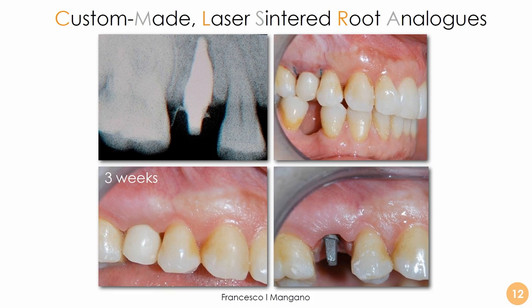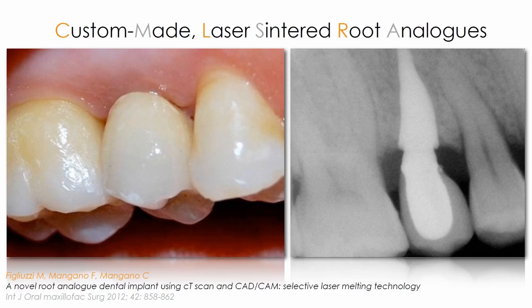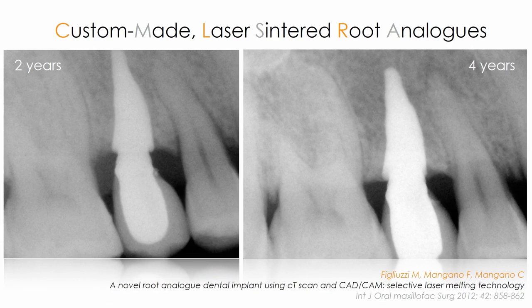And in this case, Professor Figliuzzi performed an immediate loading, even if it's not functional, and after 3 weeks we can see a perfect integration with the provisional in situ. In this case we are talking about a cemented restoration. It is the way it looks after 1 year with the restoration, and the publication was made in 2012 basically, and this implant now has been in position for many years. We are talking about 8 or 9 years of follow-up, and it works perfectly.